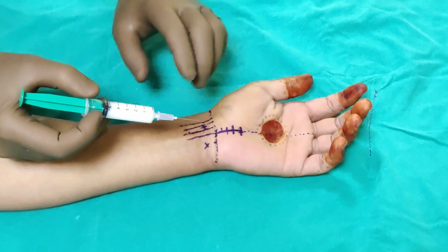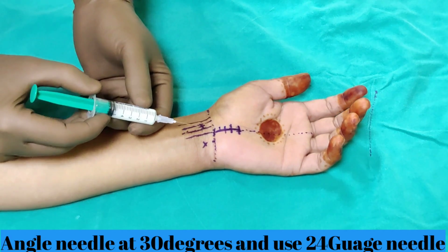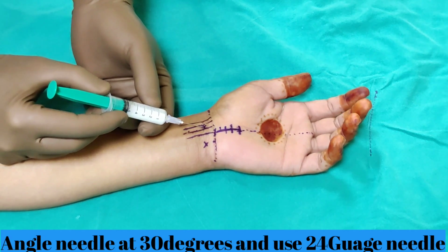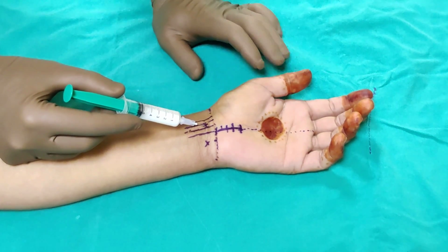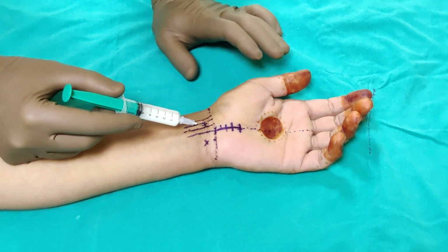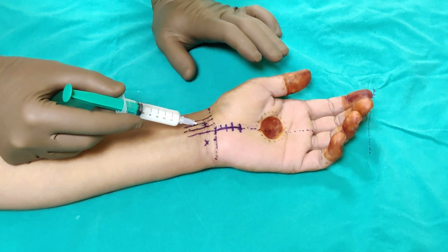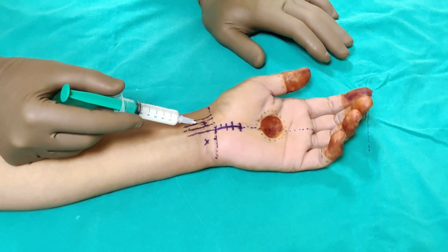So I'm ready. This is my site of the injection, roughly 30 degrees, and just go straight in. If at any point you are close to the median nerve, the patient will complain of a sharp shooting pain, and occasionally you may see twitching of the fingers. That means you are very close to the nerve.